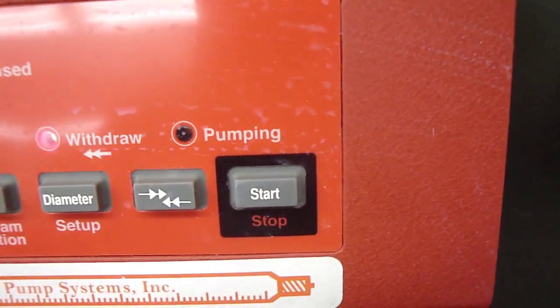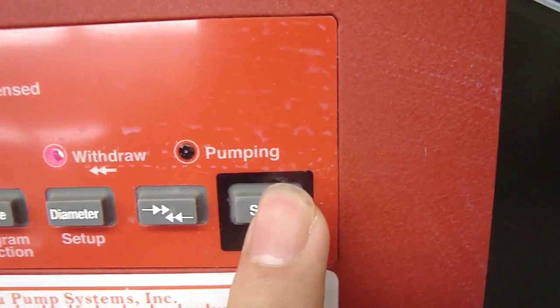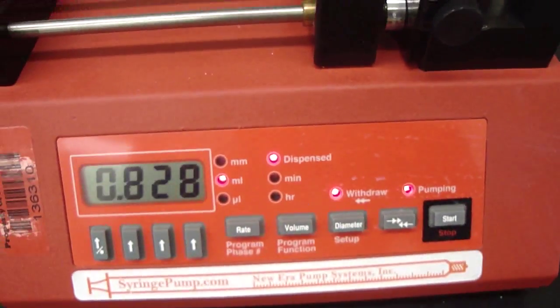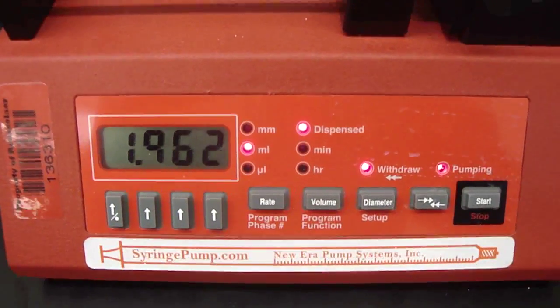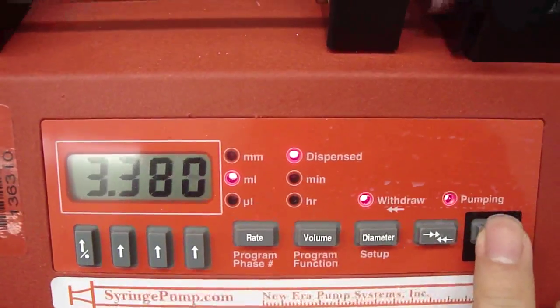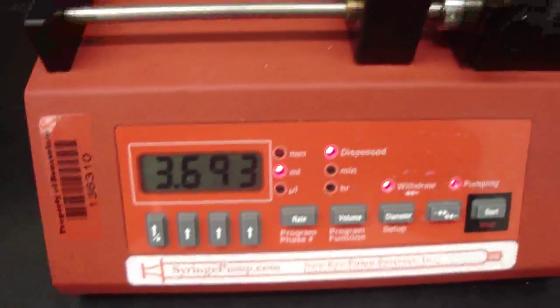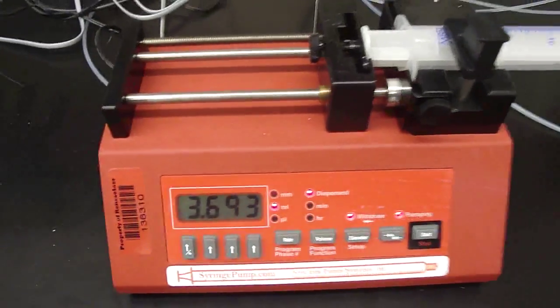And when everything is all set, you can just press the start button to make it work, as you can see from the screen. And you can press the start button to stop it anytime. That's pretty much how you can use this syringe pump. Thank you.